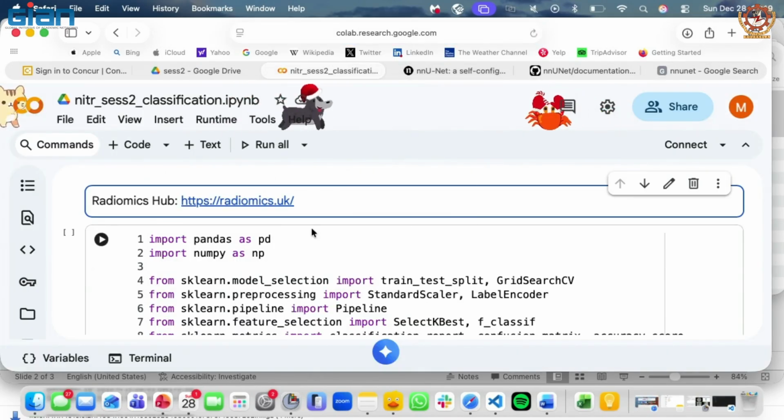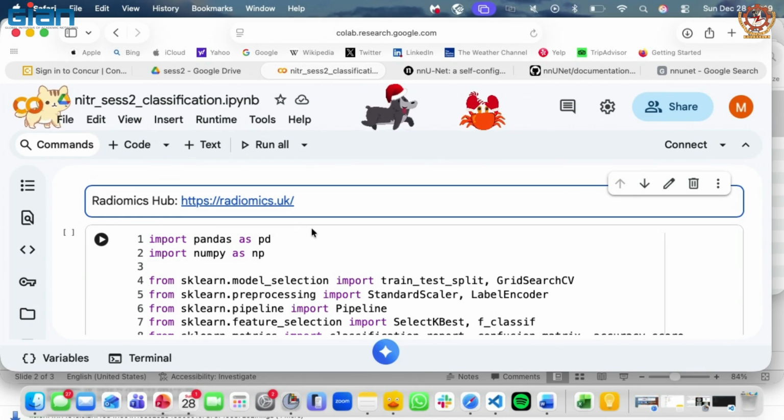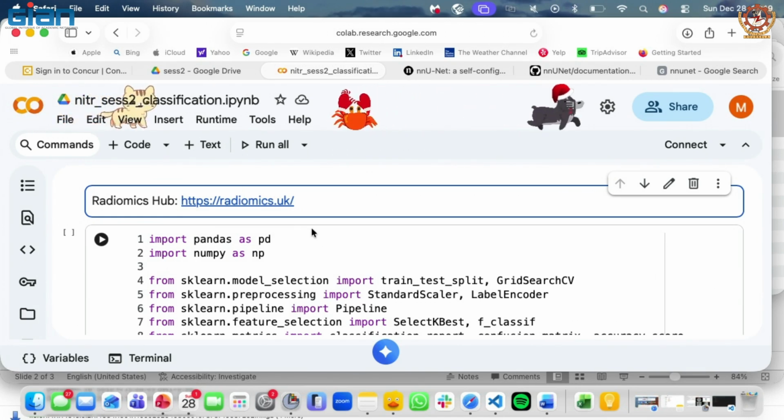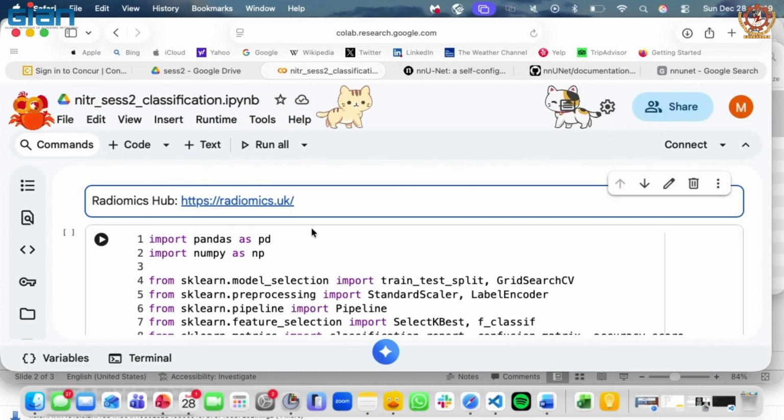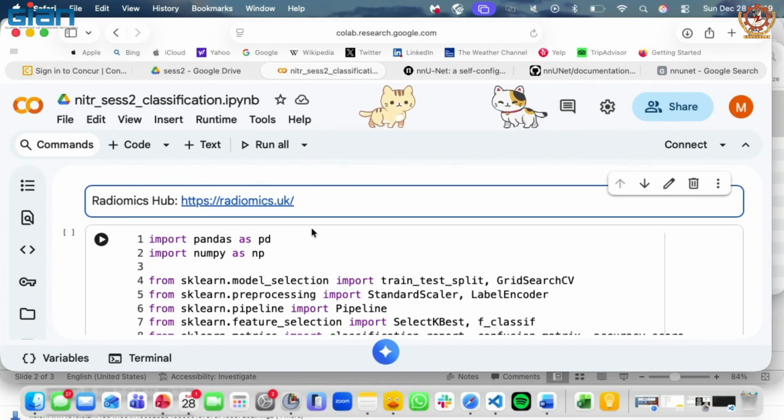Okay. Why I want to emphasize this, because this is the last and I would say one of the most important things if you're trying to do some project. Yesterday I discussed radiomics. If you listen to Dr. Prasanna's lectures, he was emphasizing radiomic features and doing different downstream tasks using them. I also discussed TCIA, which has huge data sets, and you had a question about how to download them.